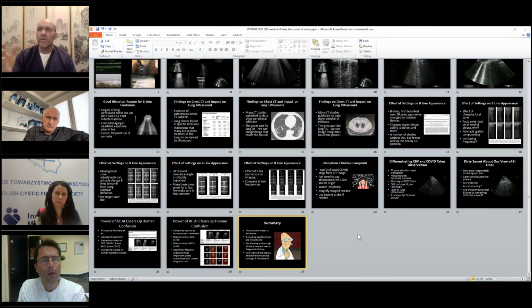And I think there are many versions or subtle differences of these scores, and one needs to use them consistently in their medical center. Yeah, because I think this is one of the major problems, that there have been so many different proposals, and even within the same hospitals, different units might use different scores.